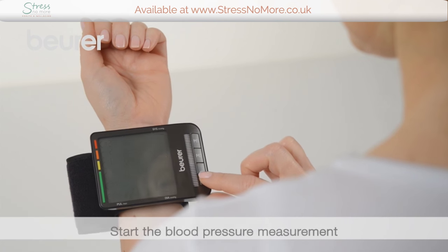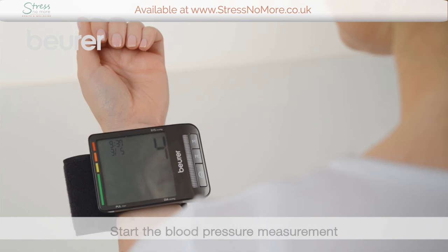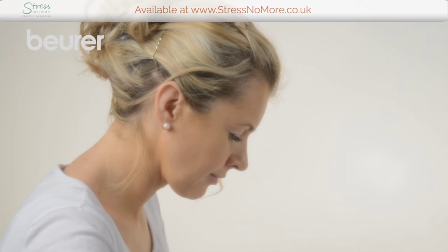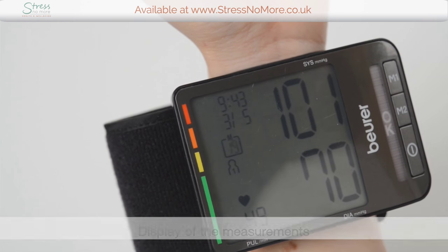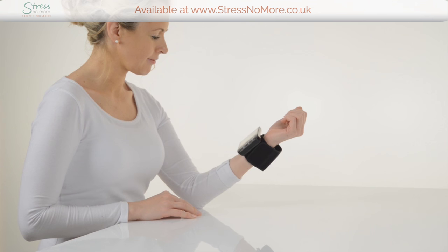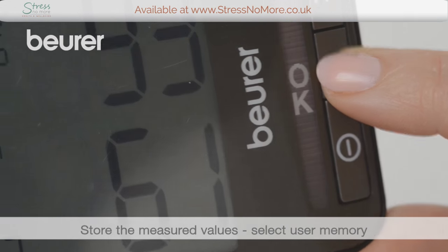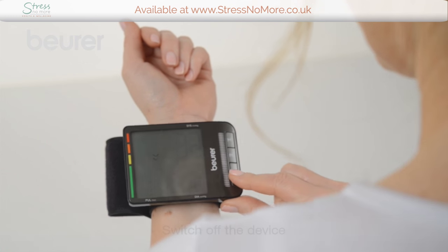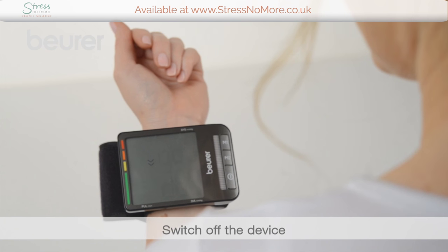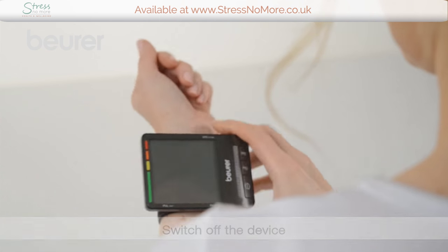Press start-stop. All displays are briefly illuminated and the measurement begins automatically. Systolic pressure, diastolic pressure, and pulse measurements are displayed. To save the values, now select the desired user memory by pressing the M1 or M2 memory buttons. To switch off, press the start-stop button. After 1 minute, the device switches off automatically.